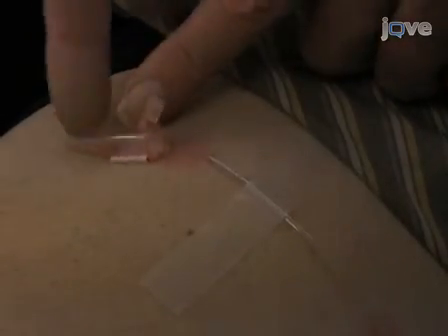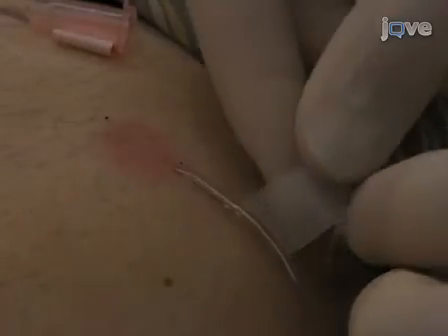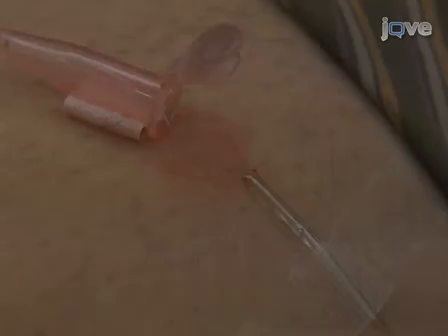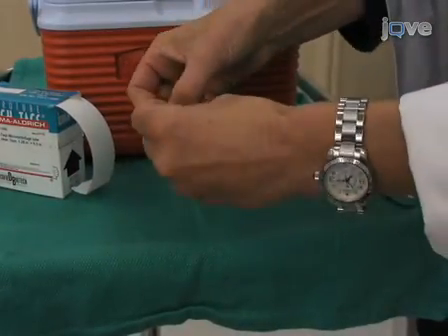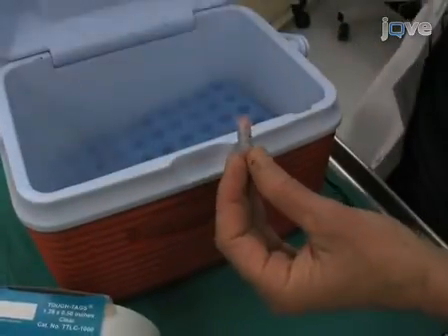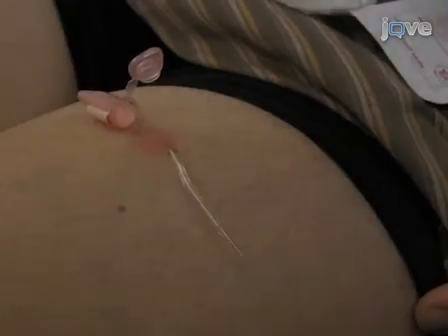In case the volumes do not match up, check to see if there is leakage from the skin entry site. Leaks can sometimes be resolved by pulling the part of the catheter that is embedded by the plastic tubing more tightly onto the skin entry site. Alternatively, a catheter may need to be replaced if delivered and collected volumes do not match up. Once sampling is complete, the samples are placed on dry ice until storage at -80 degrees Celsius.